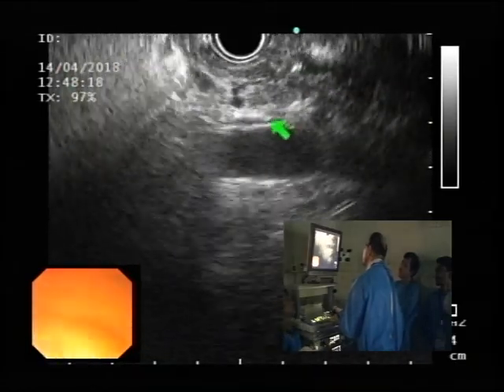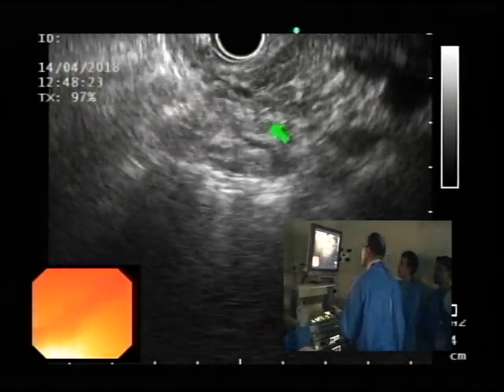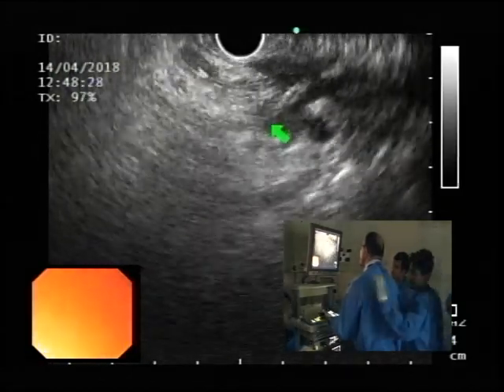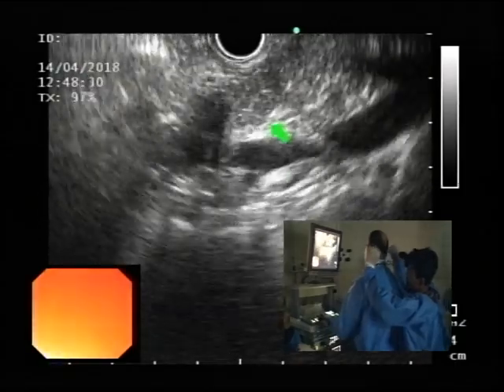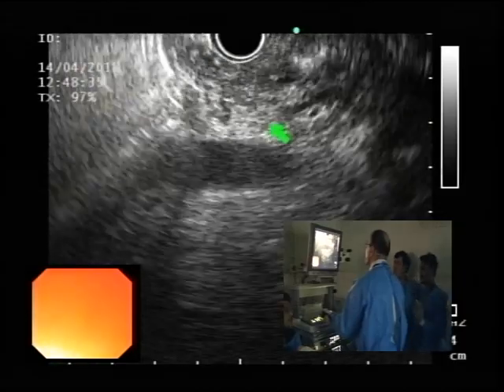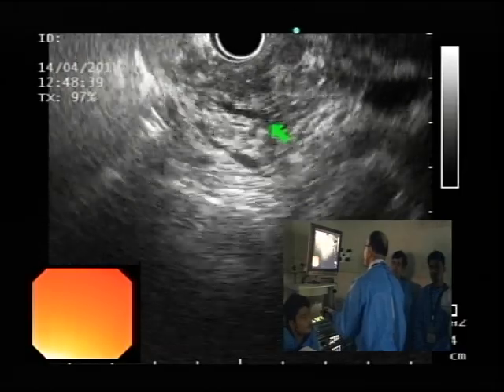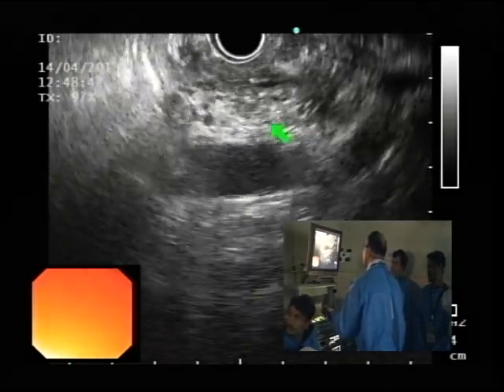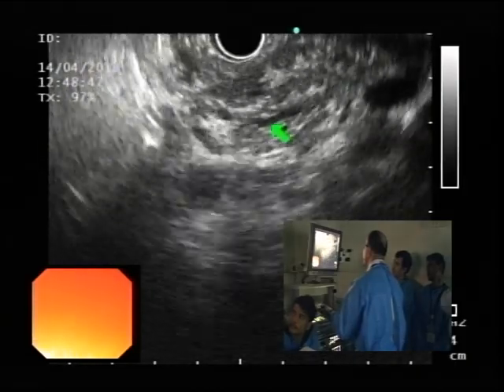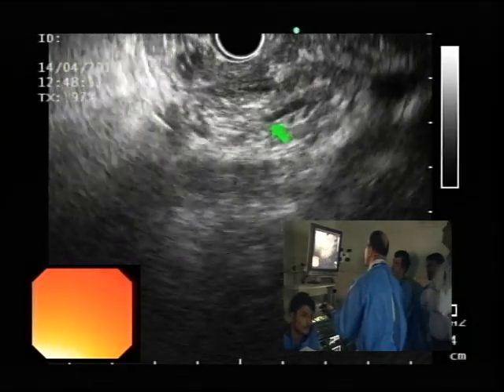But just to look for dorsal, from this area, if I have bile duct in view, if I go clockwise 90 degrees, I should ideally see the dorsal duct. That looked like air in the bile duct. Yes. So here, PD, and bile duct. And as I pull back a tiny bit, I still have bile duct in view, and you have a PD there too. It's going upwards towards the portal vein, and the bile duct is above it.